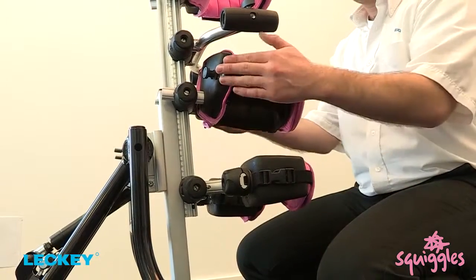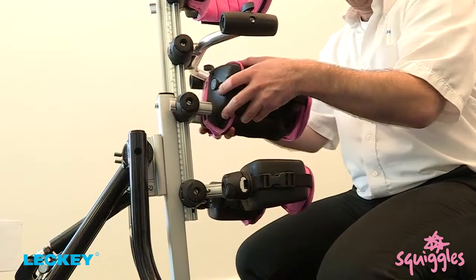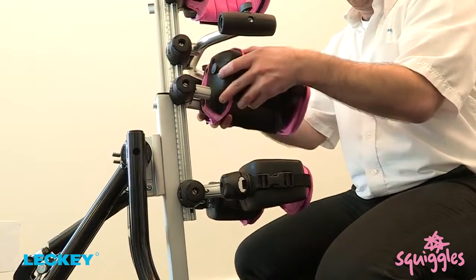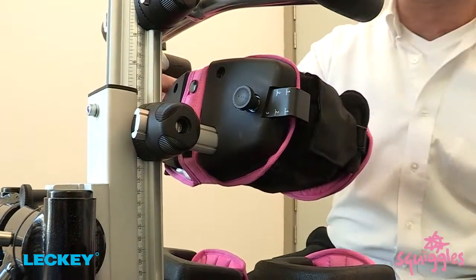The hip and knee sections can be height, depth, and angle adjusted using the coffee jar lids also. All sections can be locked tight with a straight head screwdriver.